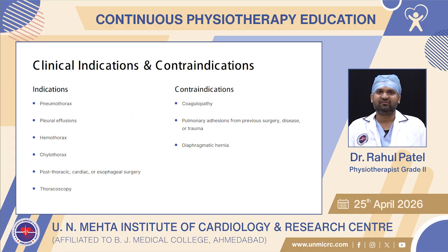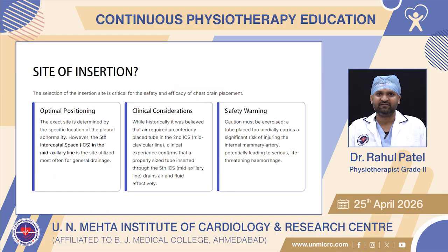Clinical indication and contraindication. What are the indications for chest drainage? Pneumothorax, pleural effusion, hemothorax, chylothorax, post-thoracic, cardiac or esophageal surgery, thoracoscopy. What are the contraindications for chest drainage? Coagulopathy, pulmonary adhesion from previous surgery, disease or trauma, diaphragmatic hernia.